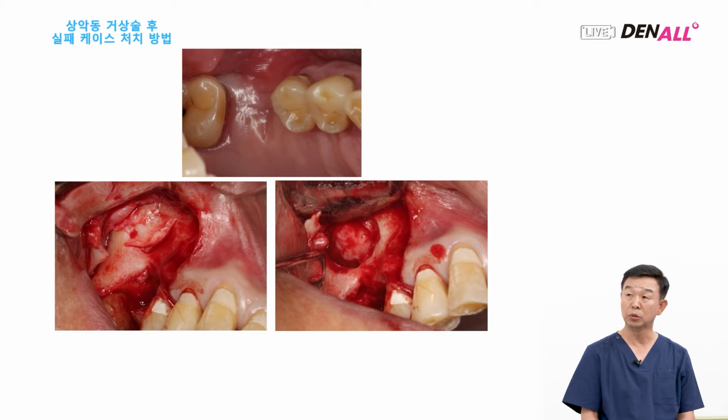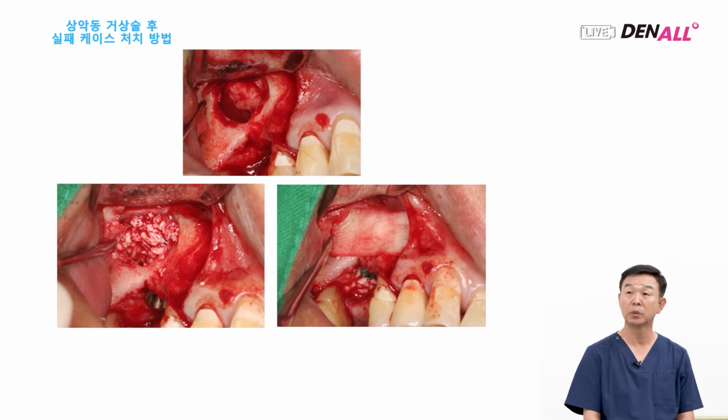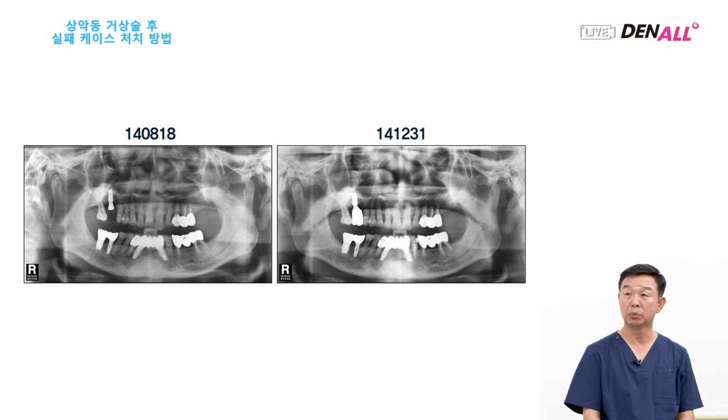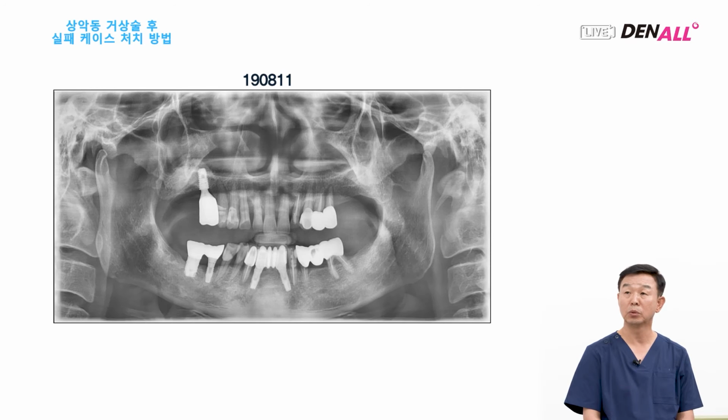So in the usual way, the window approach is used. Bone graft and implant placement were done simultaneously. Next, post-op pictures. The final prosthesis was delivered. Post-op 5 years. So Dr. Yang gave us a very good point.